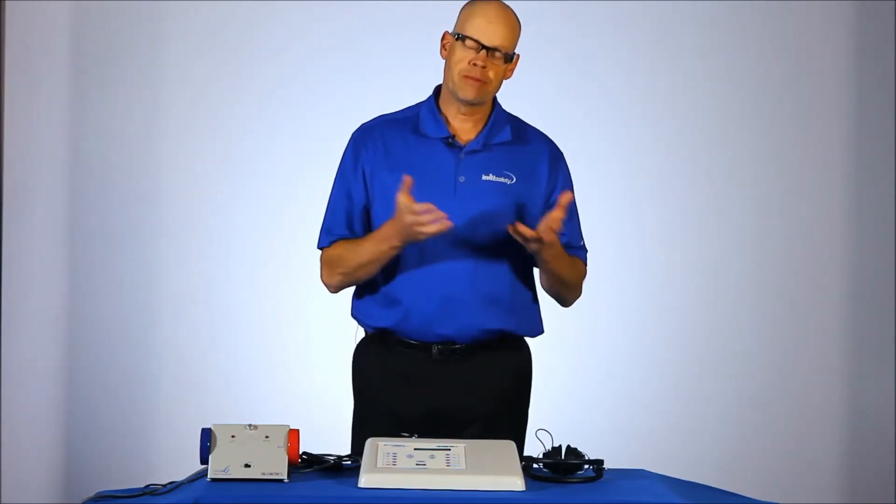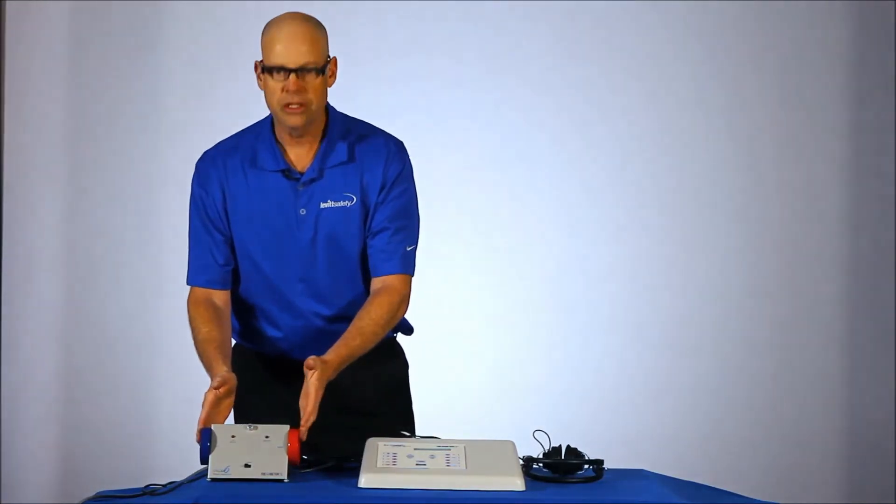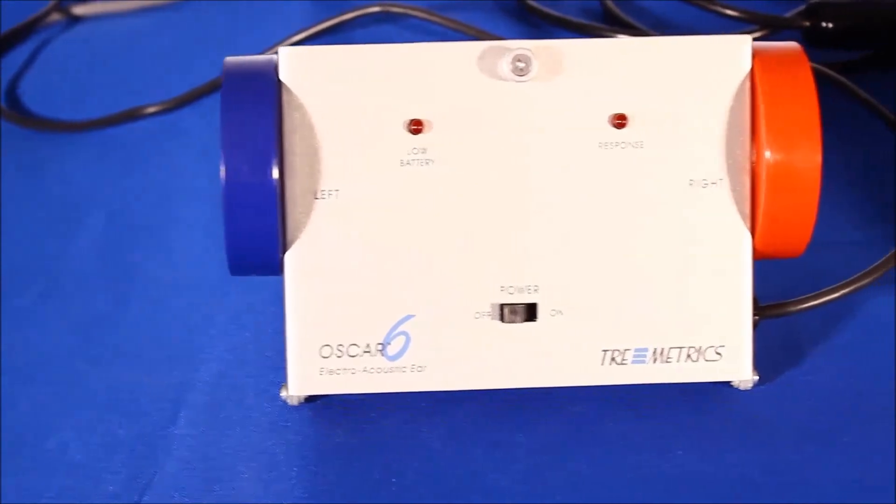The other product we would always recommend with this device is the bioacoustic simulator, in this case the Oscar VI. That helps you perform your daily calibration.